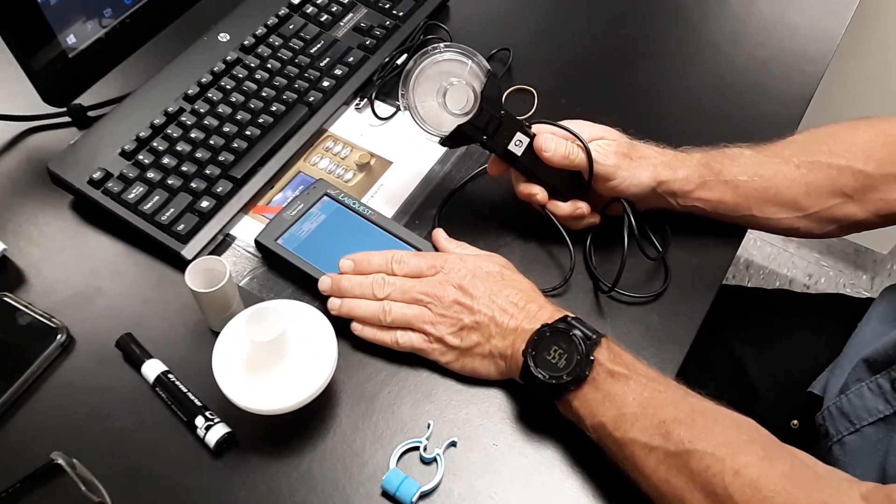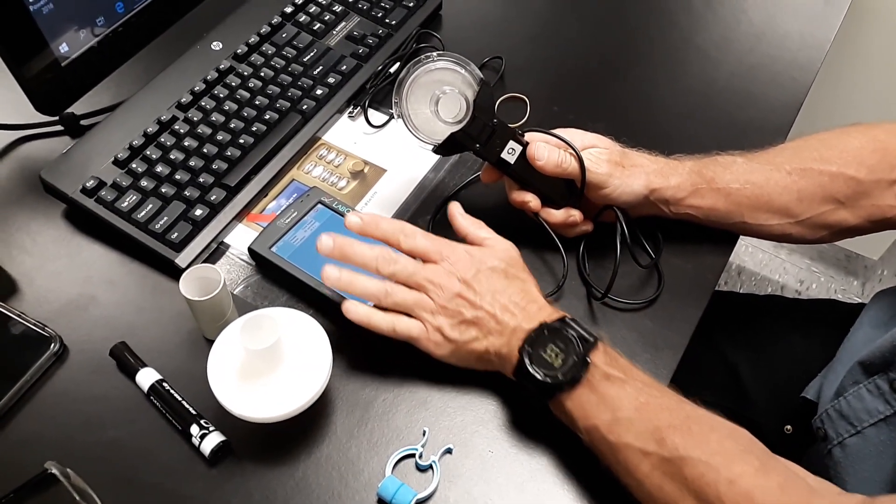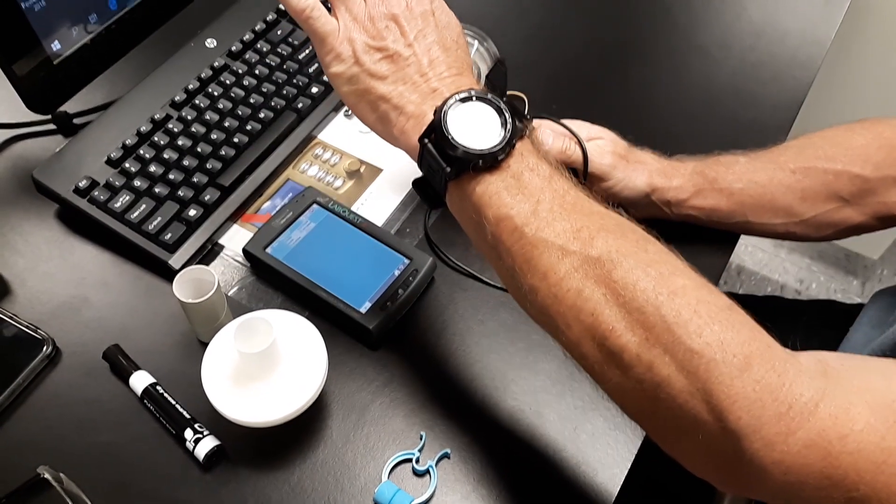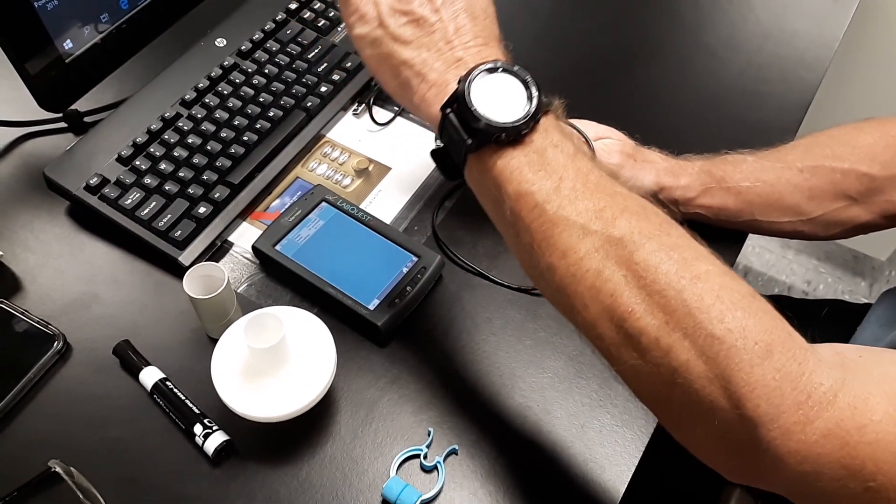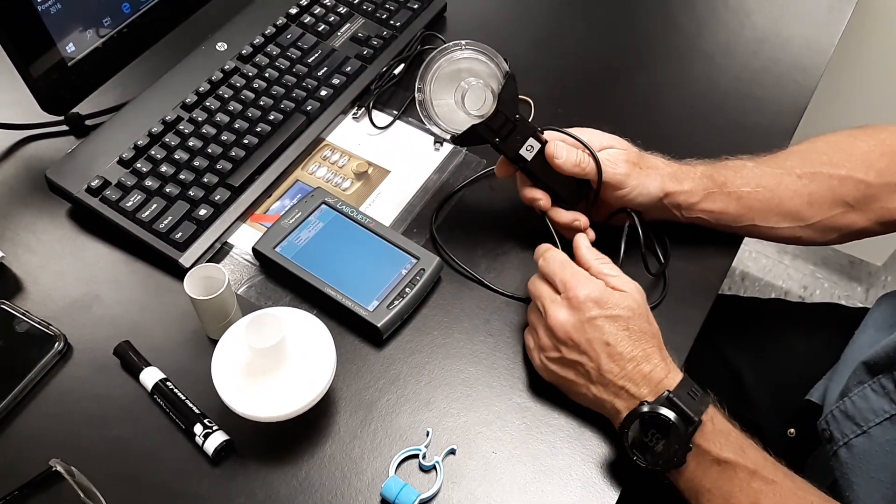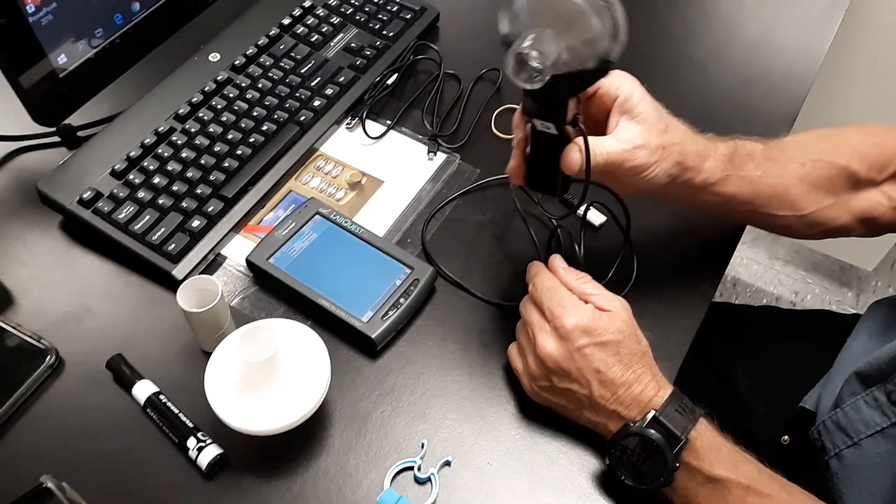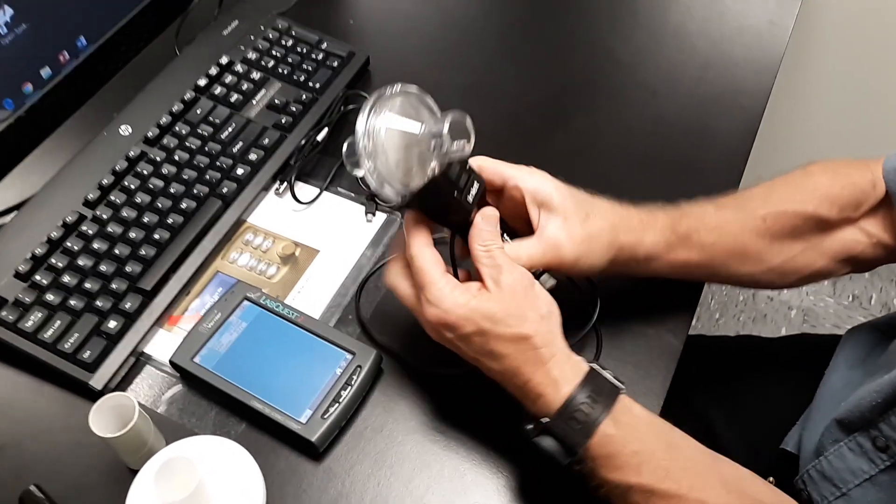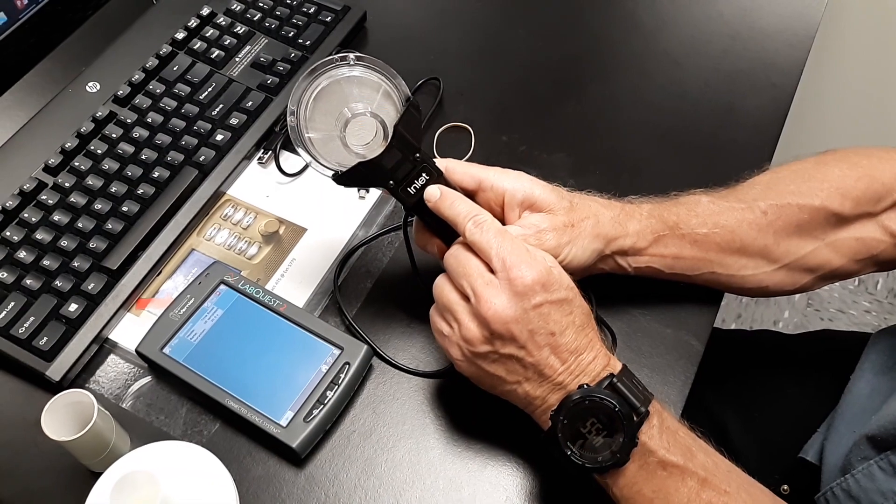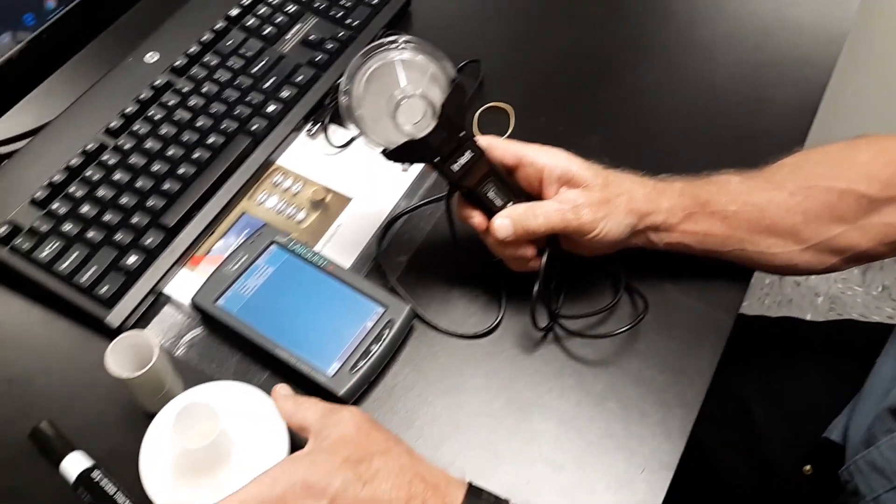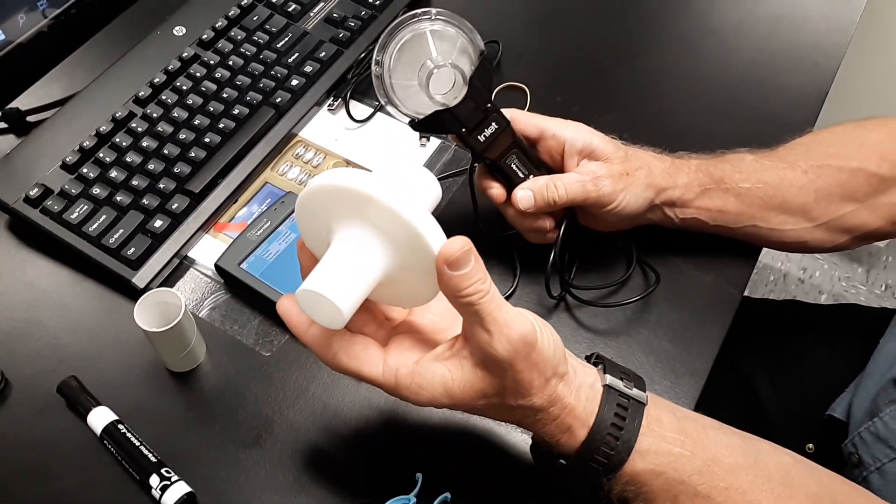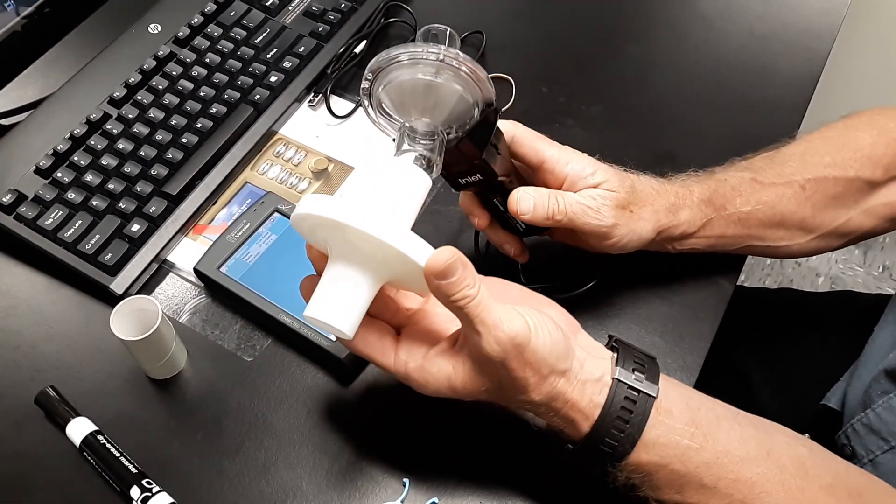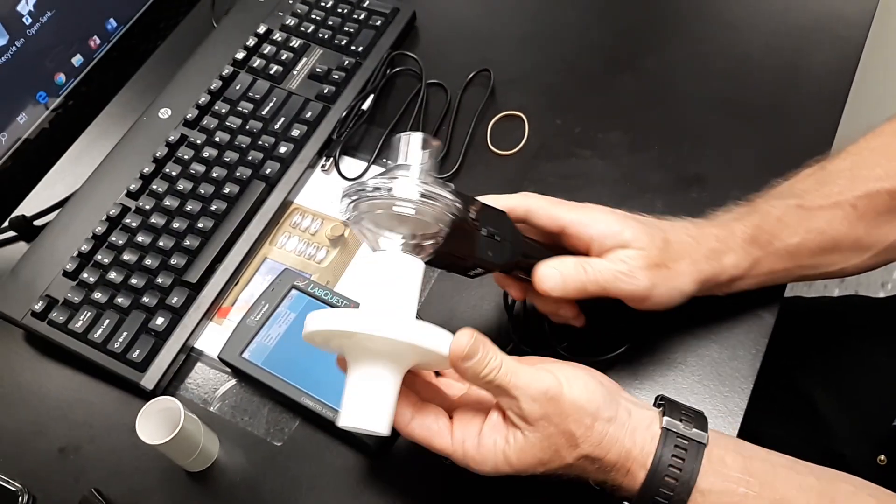We're going to actually use the LabQuest, but we're going to have the LabQuest graph projected onto computer screens today. First thing we want to do is show you how to set up the spirometer. If you notice here, we have one side that says inlet. You're going to take your bacteria filter, the large end of that, large side of that.